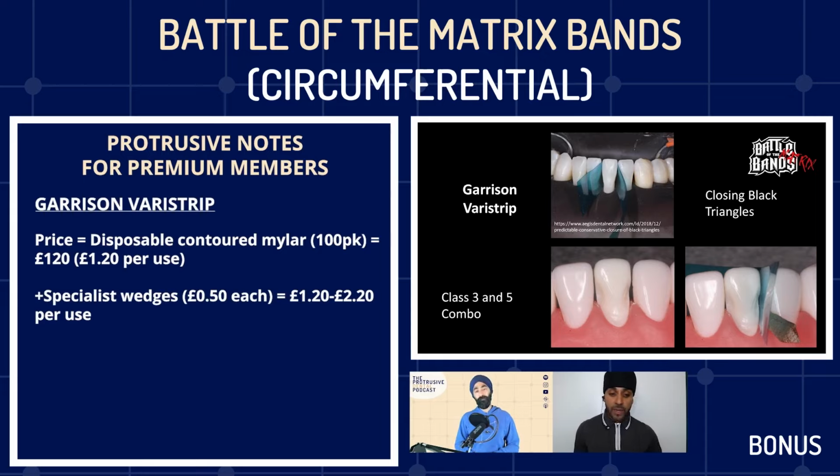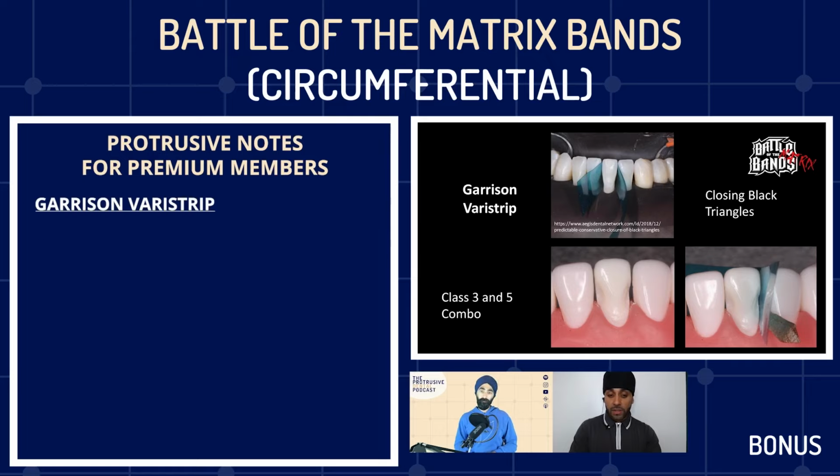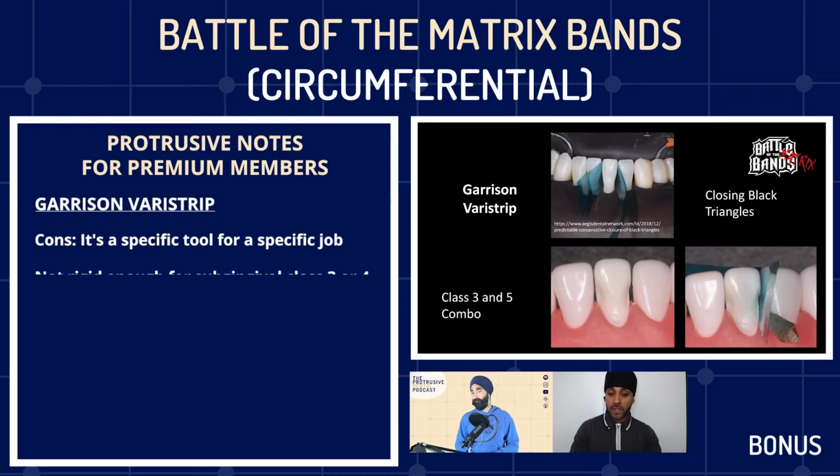So it is good, but let's talk about the pros of it, right? It's ready to go, there's no setup, you know, you'd have to set it up with a retainer. It's better suited than a straight mylar due to the built-in curve. And you can cure through the matrix, right? So some people really enjoy doing that. And the cons, I would say, would be that it's a specific tool for a specific job. And unless you can pull it off for posterior cavities, then it's not that versatile, right? You're only going to be pulling it out for these particular instances.